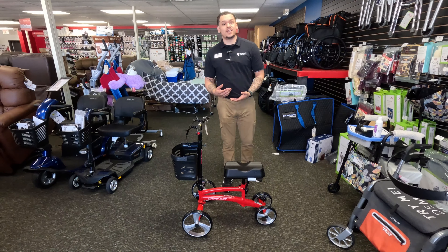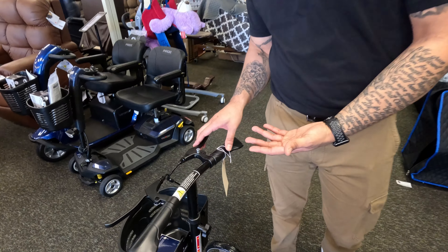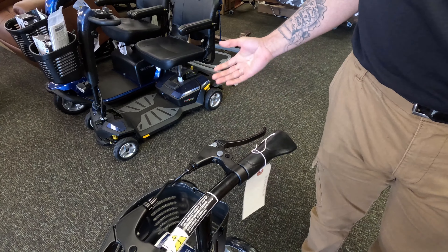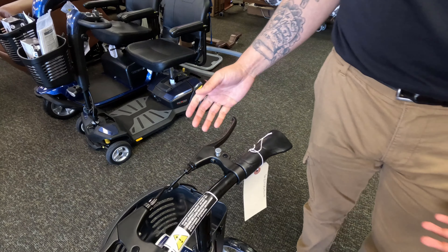We're going to go over some of the key features for this. We'll go ahead and look at the hand brakes — what you're going to want to do to engage those is just squeeze. To lock it out, you're going to want to just push down this little lever here and it'll lock out. To release that, you just give a simple squeeze just like that.